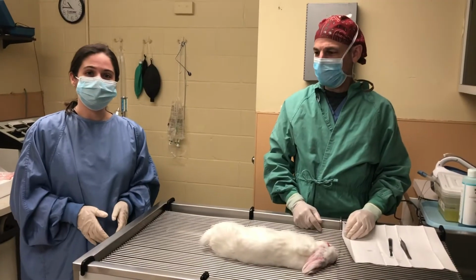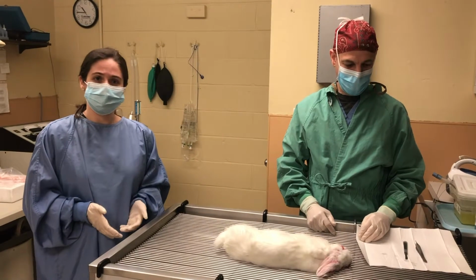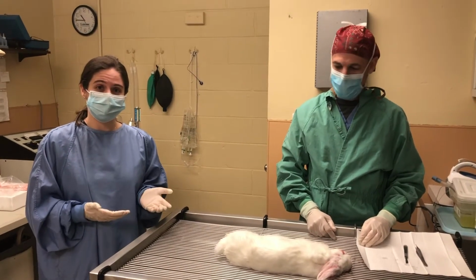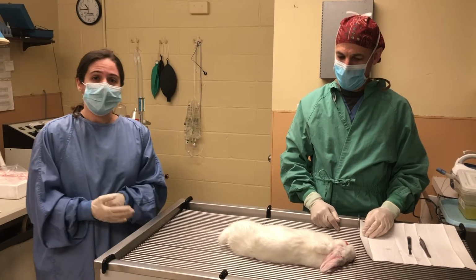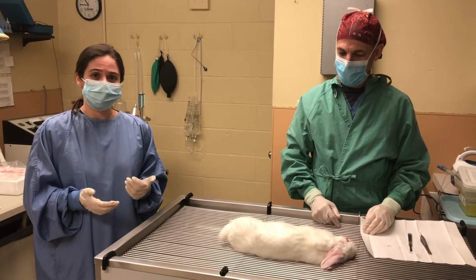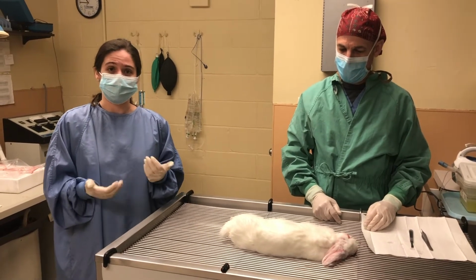In this video, we're going to demonstrate how to perform a necropsy. A necropsy is a post-mortem examination performed by a doctor, usually at the request of an owner after an animal has died. Most necropsies are performed on animals that have died of an unknown cause, and the owner wants some peace of mind as to how that happened.